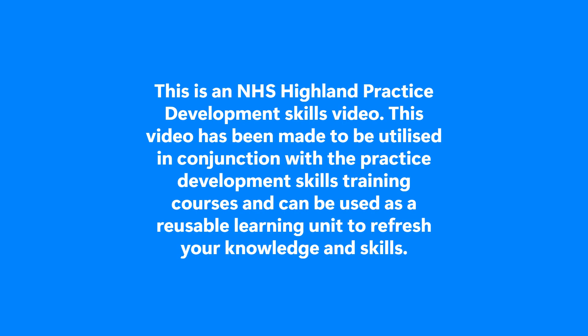In this video you will learn about the procedural steps for performing cannulation, including the equipment required. This is an NHS Highland Practice Development Skills video.